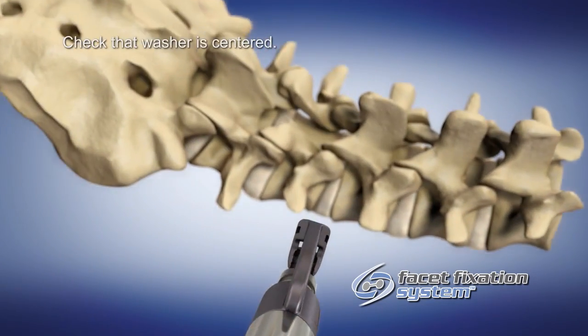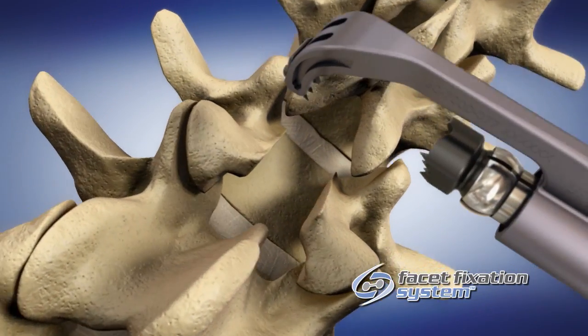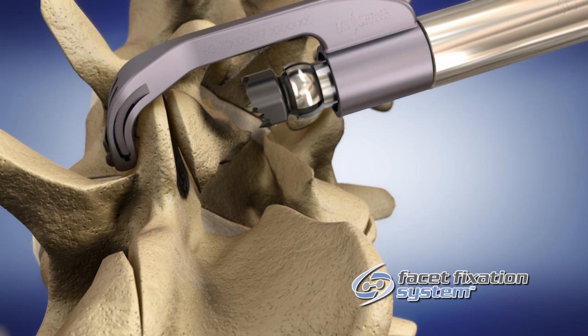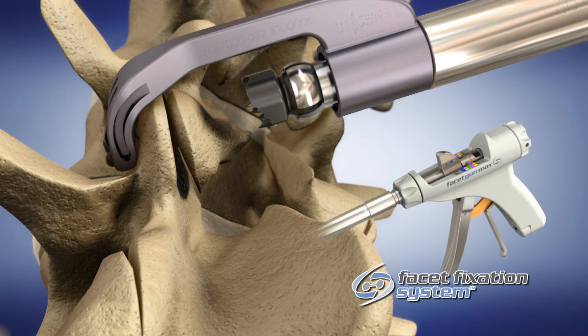Insert the facet gun into position over the L4-L5 facet joint. Once over the joint, pull back slightly in order to secure the distal locking washer into the surface of the superior facet.